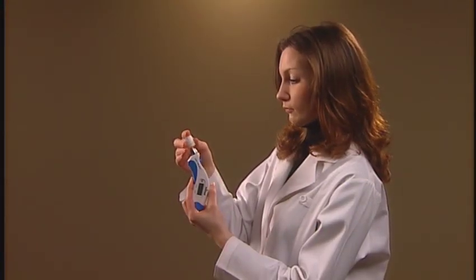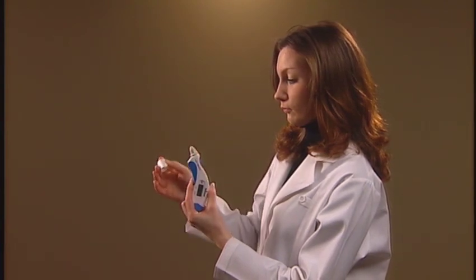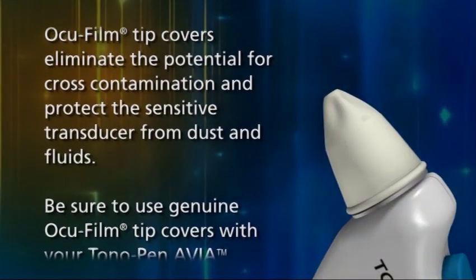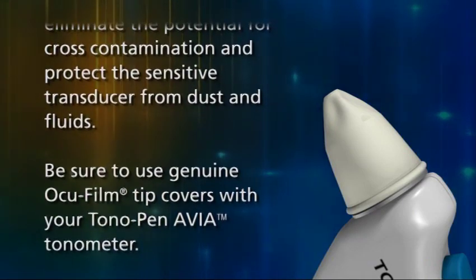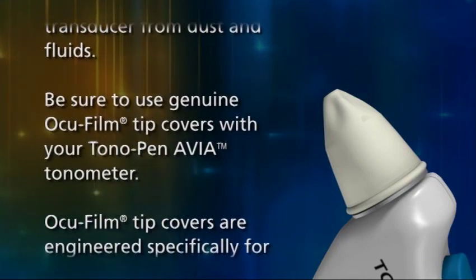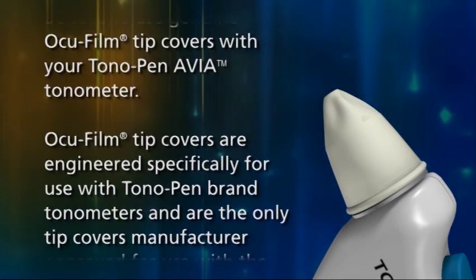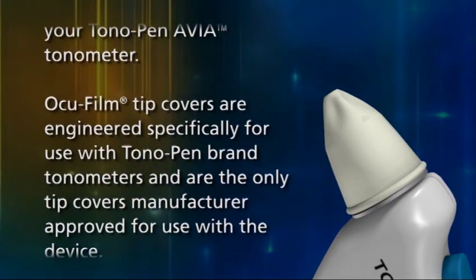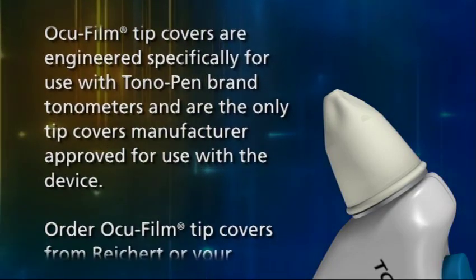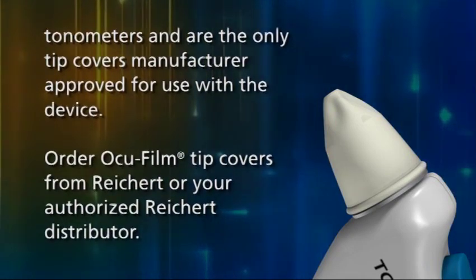The next step is to prepare the Tonopen Avia Tonometer for use by placing an Occufilm Tip Cover on the transducer. Occufilm Tip Covers eliminate the potential for cross-contamination and protect the sensitive transducer from dust and fluids. Be sure to use genuine Occufilm Tip Covers, as they are engineered specifically for use with Tonopen brand tonometers and are the only tip covers manufacturer-approved for use with the device. Order Occufilm Tip Covers from Reichert or your authorized Reichert distributor.